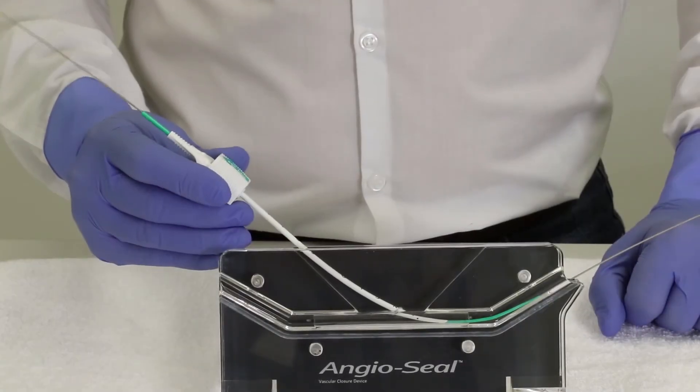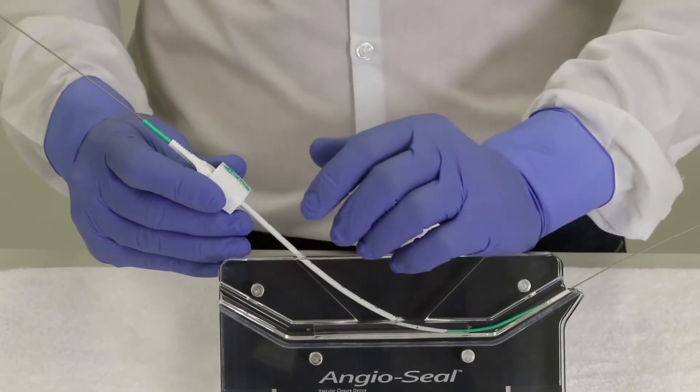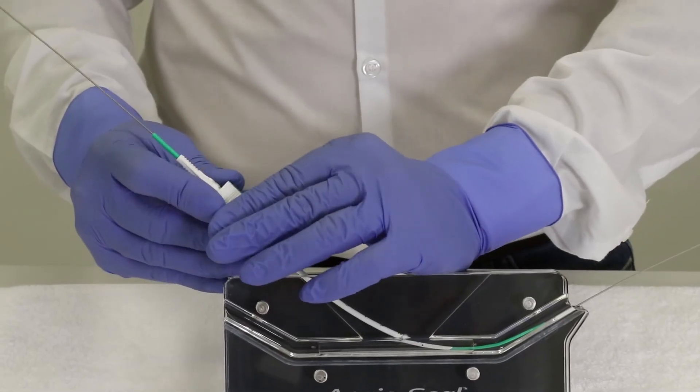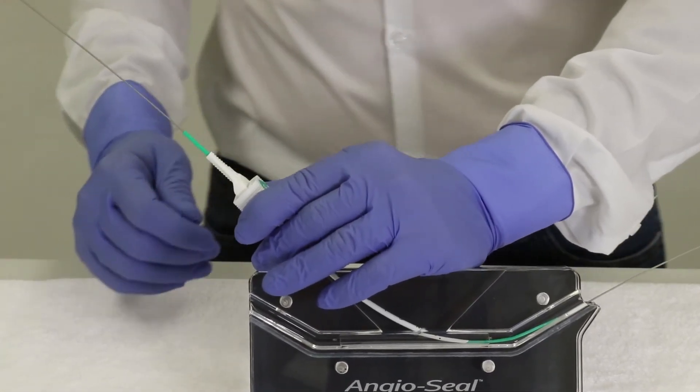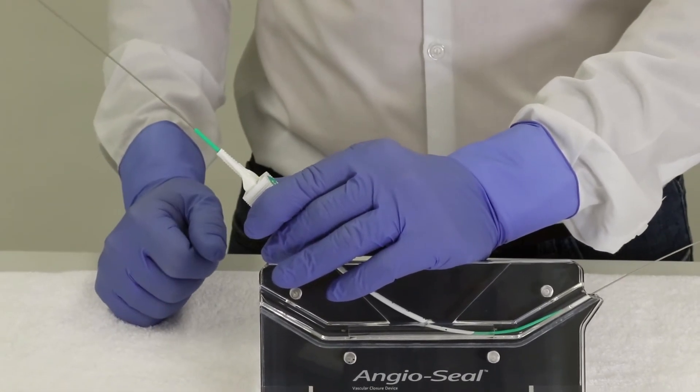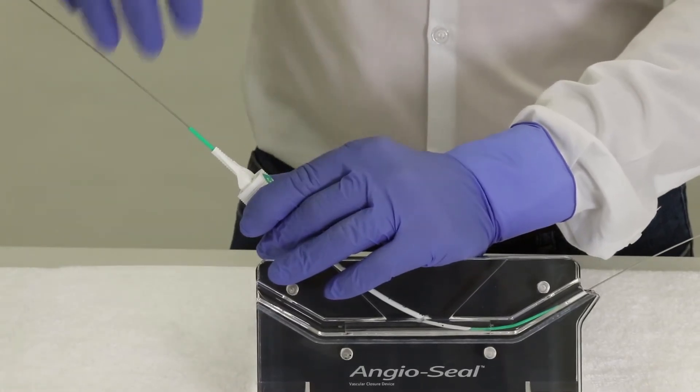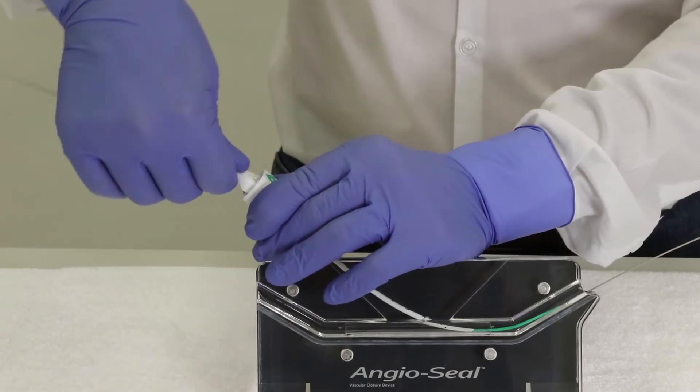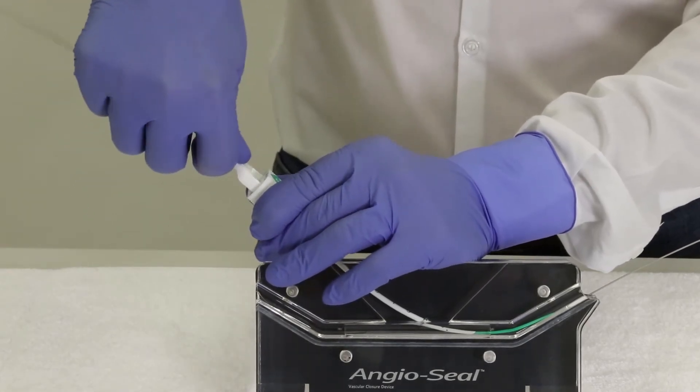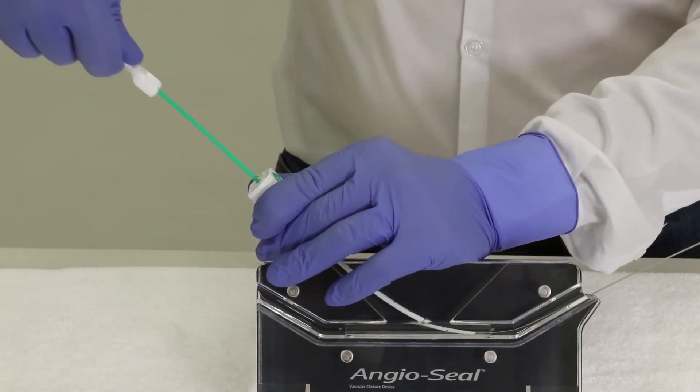Change your hand position. Put your supporting hand on the patient, holding the insertion sheath steady without moving the system into or out of the artery. With the right hand you grab the dilator, bend it down and up to remove it together with the wire, and then pull so that all come out together.